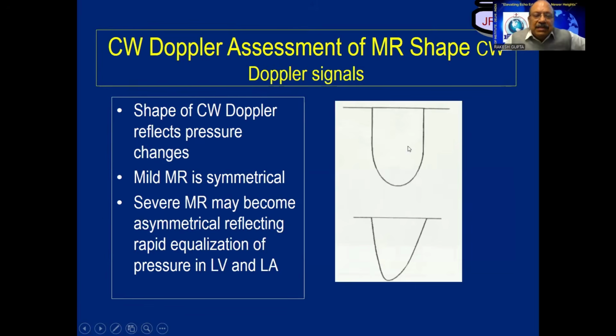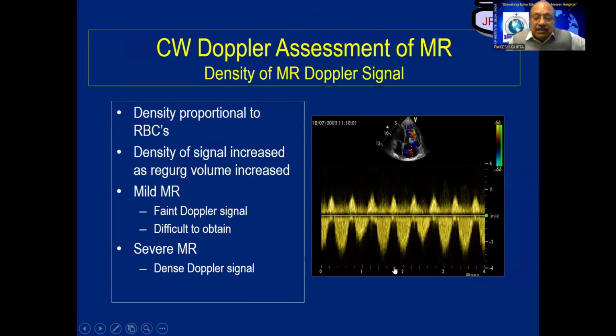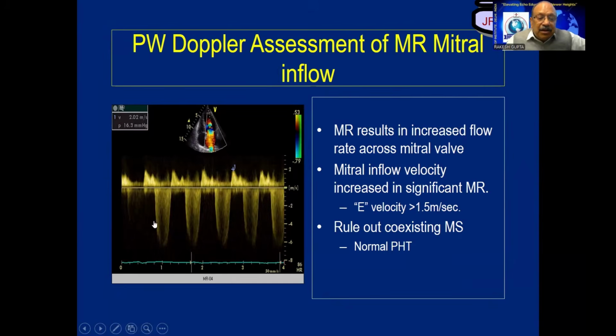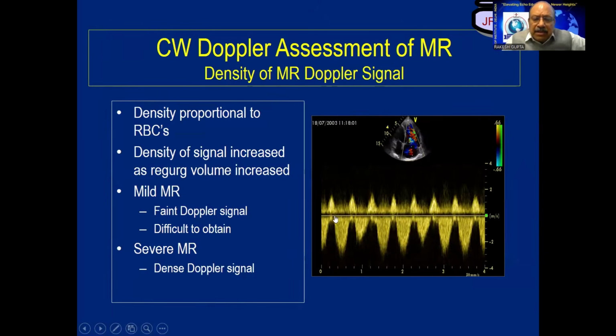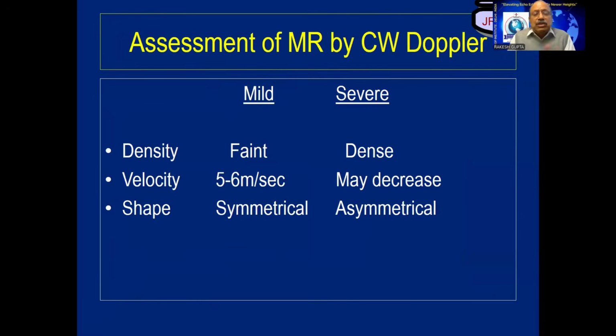Now, the third important thing is my jet Doppler spectrum pattern is almost always tongue-shaped. When it acquires a sharp acceleration time and slow deceleration time, it means it's severe. Now look at this Doppler spectrum pattern. It is still not a rounded shape, but somewhat unrounded. But look, this is a sharp acceleration time and this is a slow deceleration time. And when this happens, this itself tells you we are dealing with severe mitral regurgitation. So these are the things which help you in judging severity from the Doppler spectrum. That tells you that something wrong is happening with this patient.